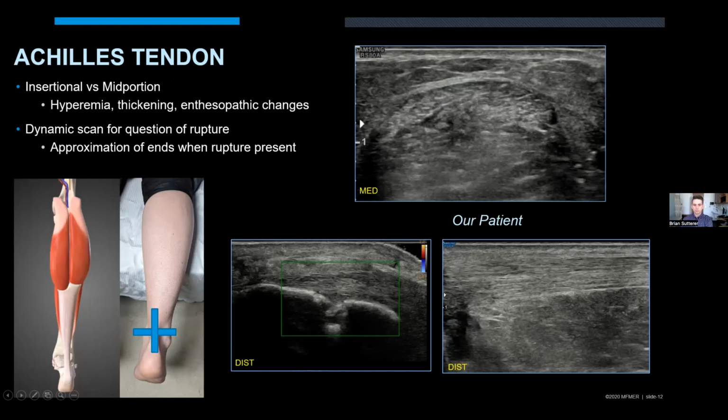In those cases, all lab markers may be negative, and they clearly have a different pattern. We don't see the big thickening of the retrocalcaneal bursa, the enthesophyte, the developing Haglund's deformity. So keep that in mind when you're looking at these. If it doesn't follow these patterns that we see, your radar should go up.